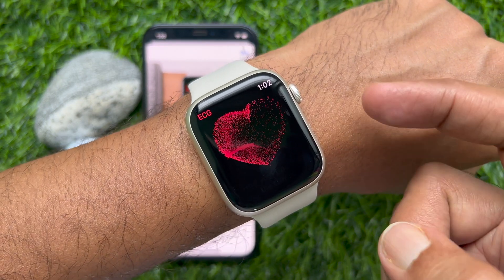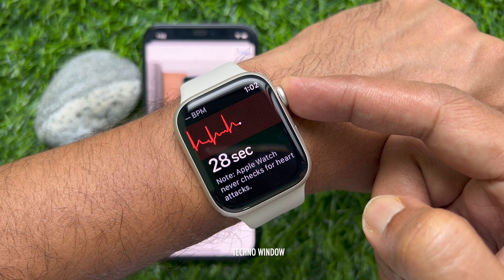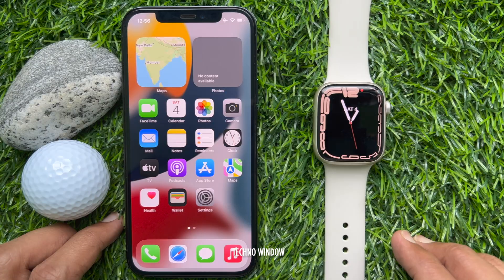Hello everyone. Today I would like to show you all how to take an ECG with the ECG app on Apple Watch Series 7. Let's have a look.